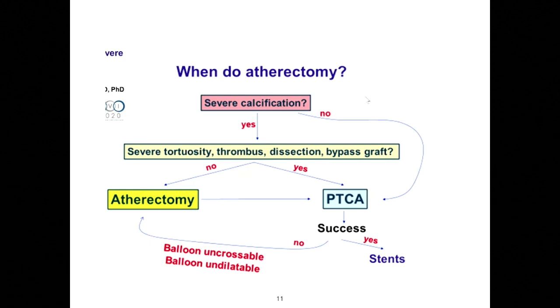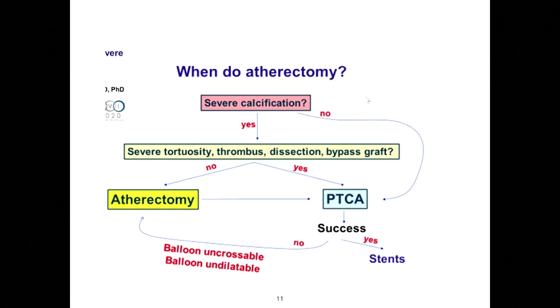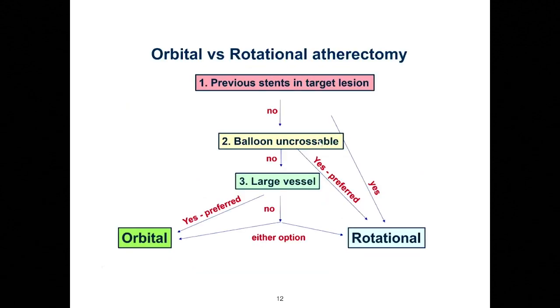The other atherectomy that is done is orbital atherectomy, but rota has an advantage in that, since it does not have a nose cone, it can be used in patients with a balloon uncrossable lesion, whereas an orbital sometimes may have a little problem. Of course, you can still use it in uncrossable lesions, but because the nose cone of the orbital prevents you from going deep, if you have an uncrossable lesion, sometimes you may have a little problem using an orbital atherectomy rather than a rotational atherectomy. Again, as I said, you could use either of them.